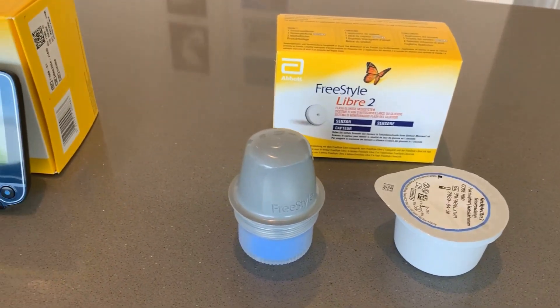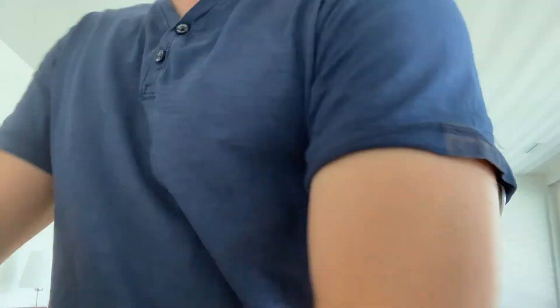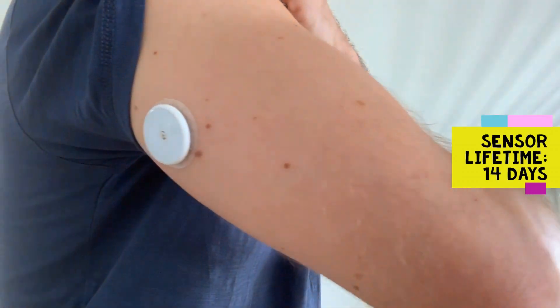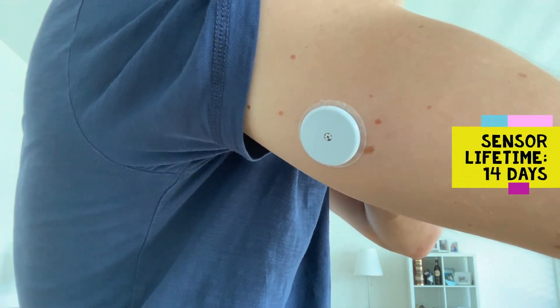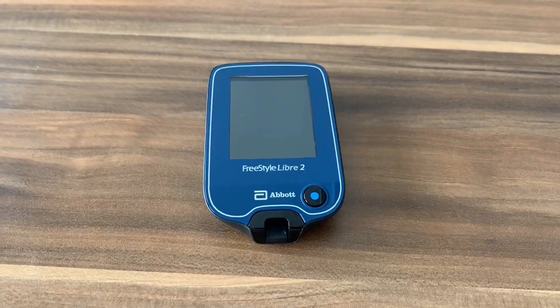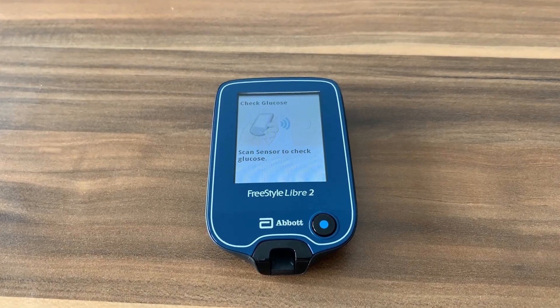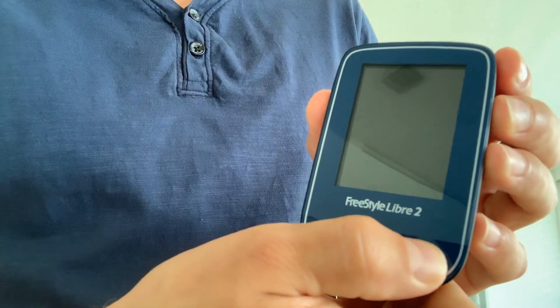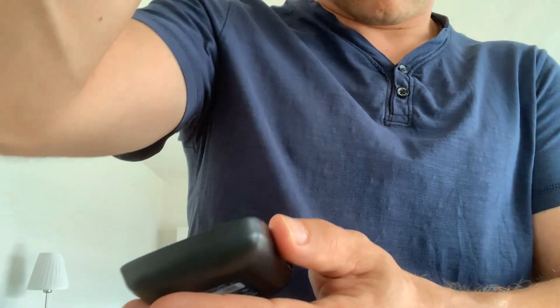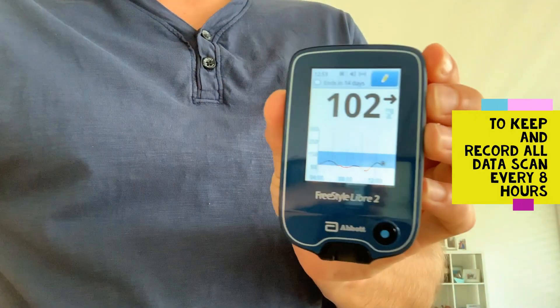As a quick reminder and for those who do not know, Freestyle Libre is a flash monitoring system containing two main parts: a factory calibrated disposable sensor that is attached to an upper arm, and a reader which is used to read the data from the sensor and also serves as a blood glucose meter. The flash monitoring system only displays and stores results when the reading is initiated by the user and only shows data for 8 hours prior to readings.